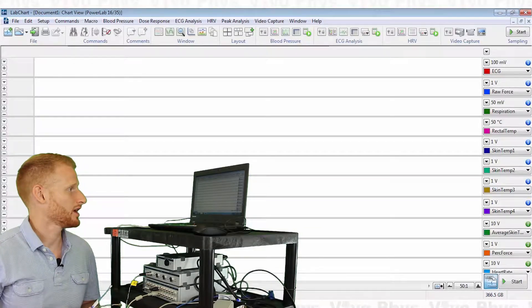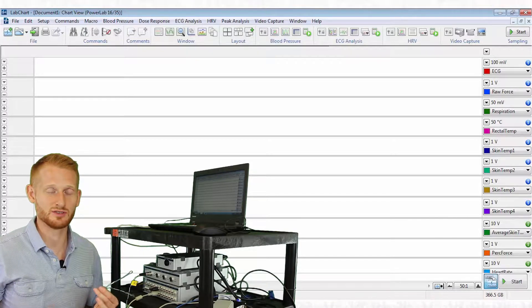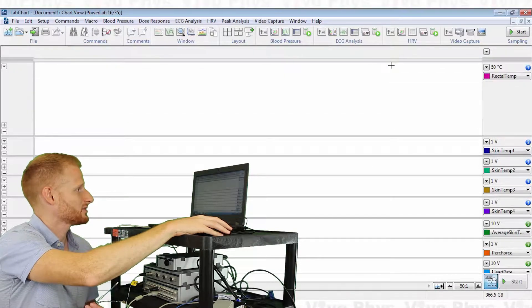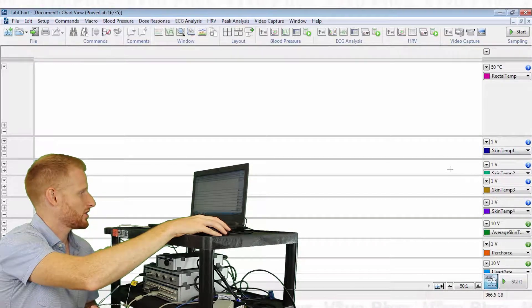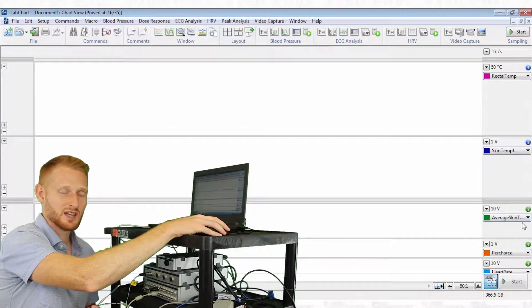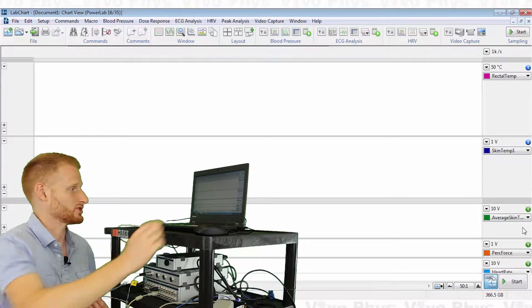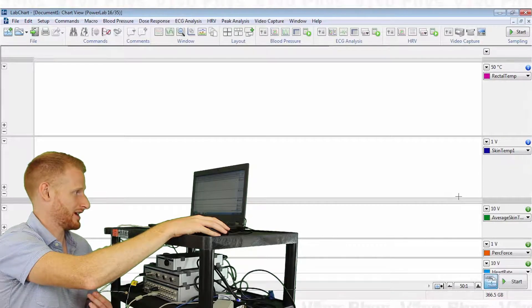We're going right into our skin and core temperature template. Lots of channels pop up because it's set up to record many things, but most we don't need today. Here's our rectal temperature channel and our skin temperature one — the only one we have connected. We don't have skin temperature two, three, or four connected. There's also an average skin temperature channel that takes the arithmetic average of all four skin channels, but we won't look at that either since we only have one connected.